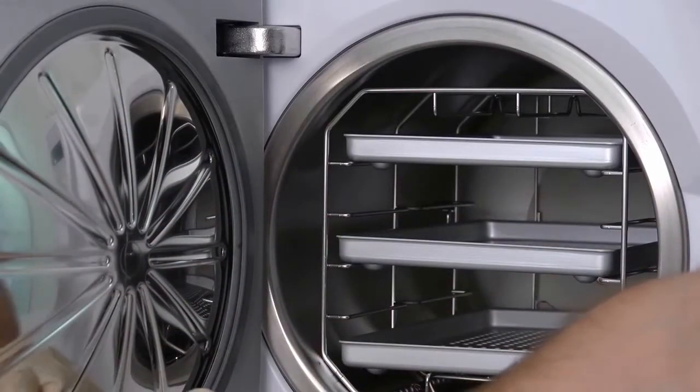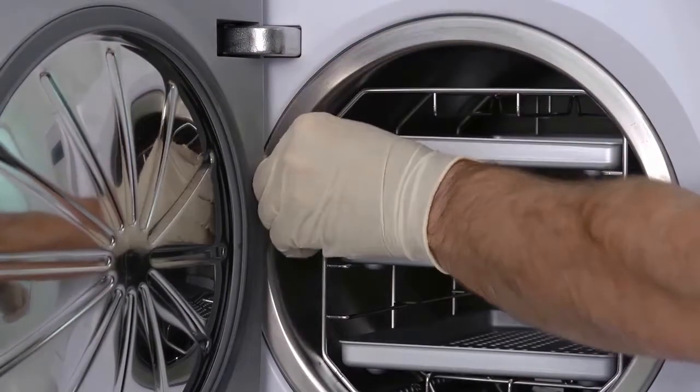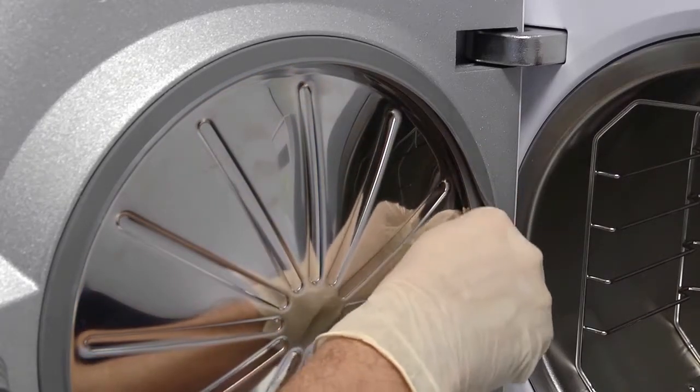The door seal should be cleaned regularly with a damp, lint-free cloth as described in your instructions for use. If you notice any imperfections with the door seal, it should be replaced immediately.